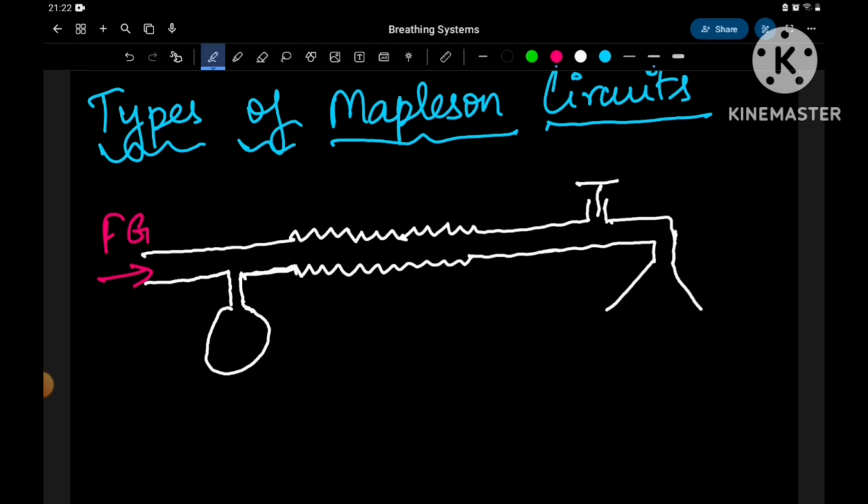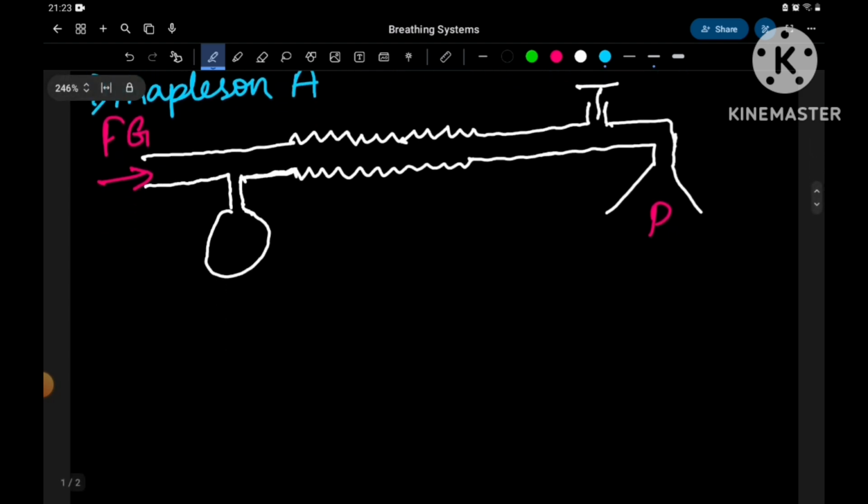Okay, this is P. Right. Okay, what is this? This is Mapleson A.